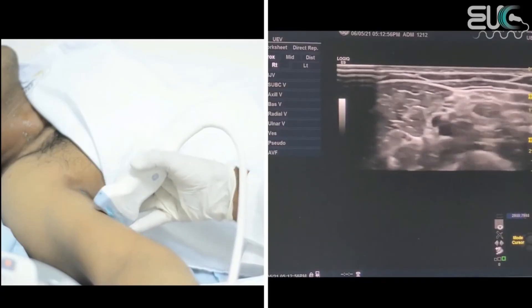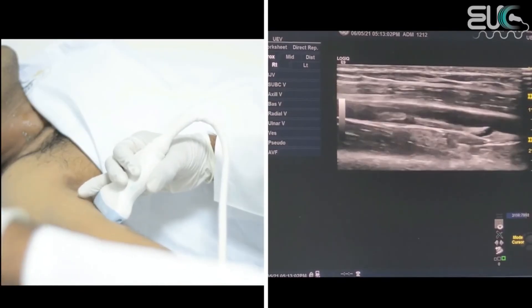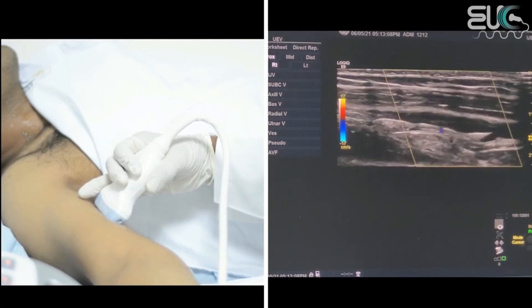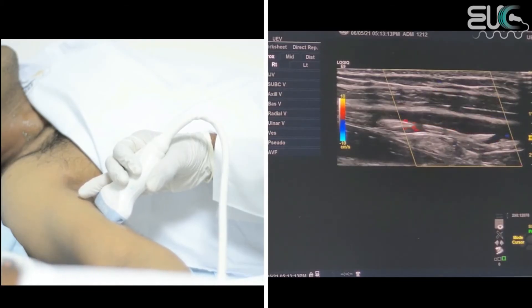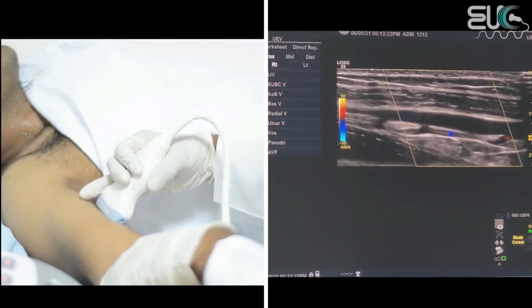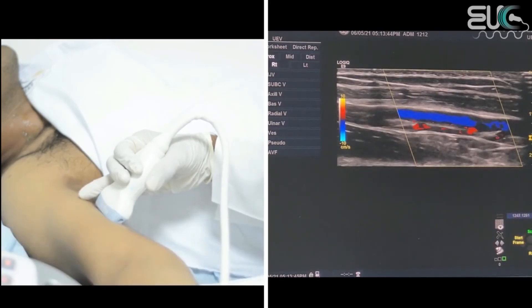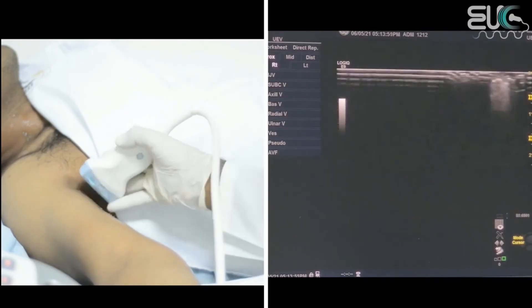After that, I will take both veins on the sagittal view and apply color. I will reduce the scale and increase the gain until I have a good signal. Here the color filling is not ideal, so I will try augmentation. When I do augmentation, as you can see, we have a good color signal. I will do it again to confirm, and here we have good color. You have to take it in both directions.